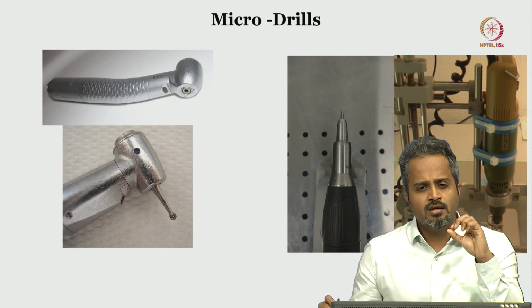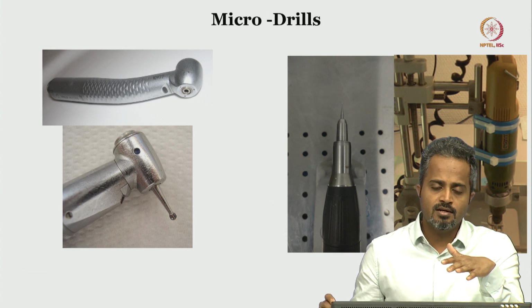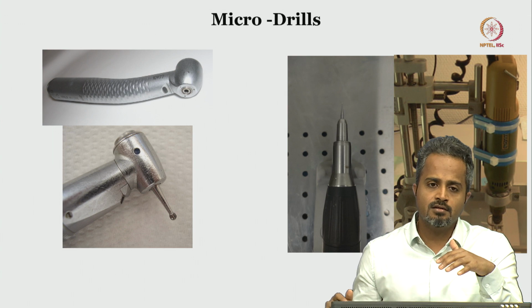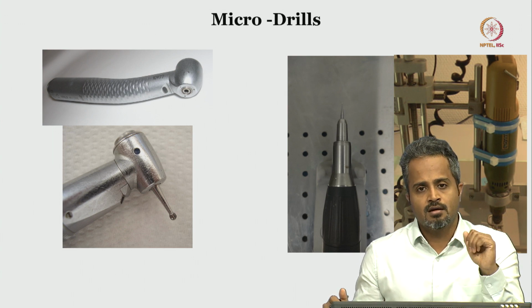These are very thin, delicate blood vessels which are easy to damage, and before you even begin your experiment, the rat either will die from the direct injury, or it will develop brain swelling, and later in the recovery time we might lose the rat.